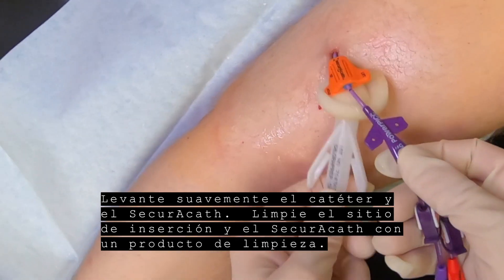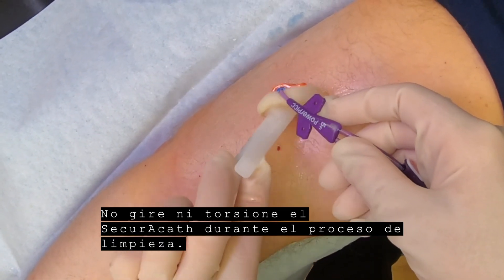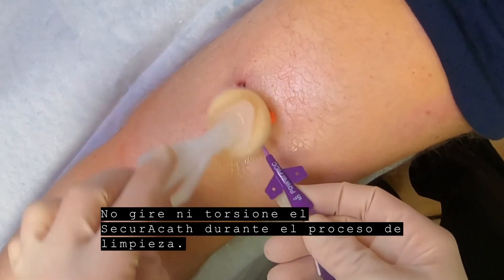Gently lift the catheter and the SecuraCath. Clean the insertion site and SecuraCath with cleaning agent. Do not twist or rotate the SecuraCath during the cleaning process.